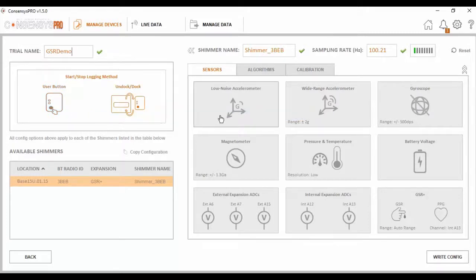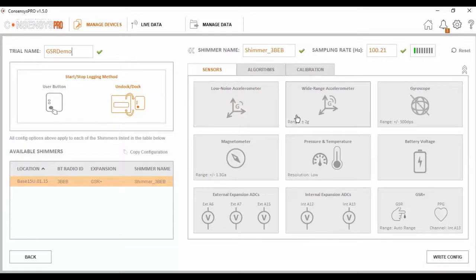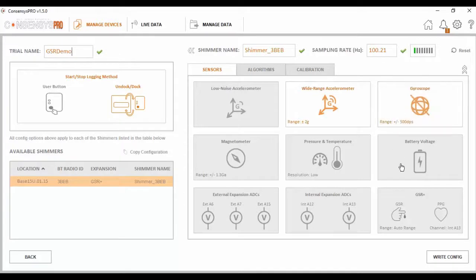Next I need to decide what signals I want enabled for my trial. This is done by highlighting a particular signal. If it is greyed out, it is not enabled. If it is highlighted, it is enabled. The range can also be set on these signals. Again for the purpose of this trial, I am going to use the wide range accelerometer, gyroscope, GSR and optical pulse.